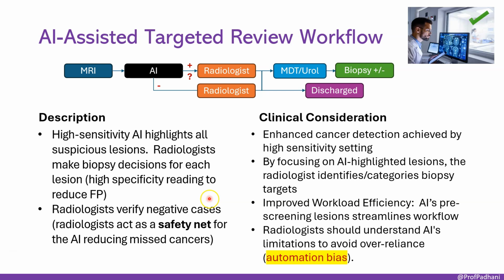The goal is enhanced cancer detection via high AI sensitivity, coupled with improved workload efficiency by focusing the radiologist's attention. However, the risk of automation bias remains. Radiologists must critically evaluate the AI-highlighted lesions and not just accept them, and must remain vigilant when verifying negative cases.